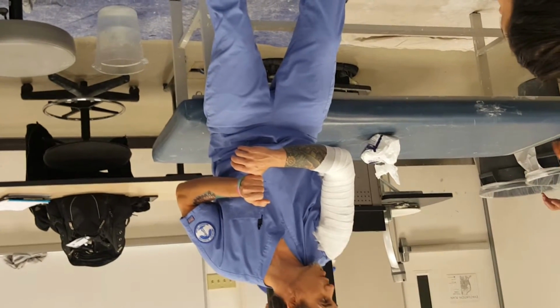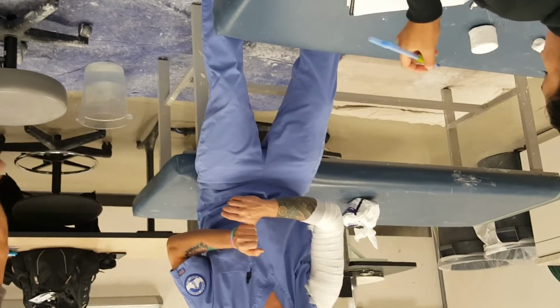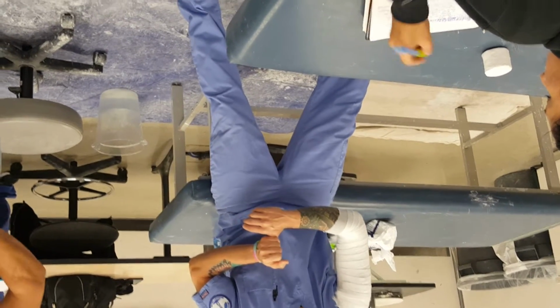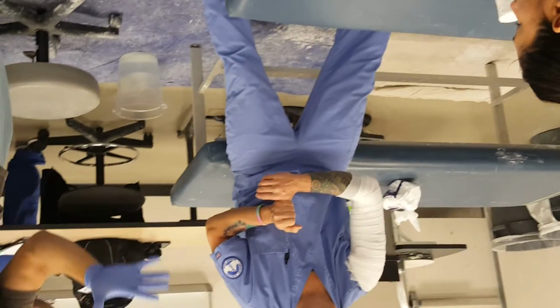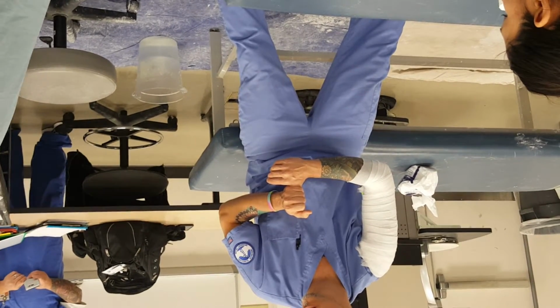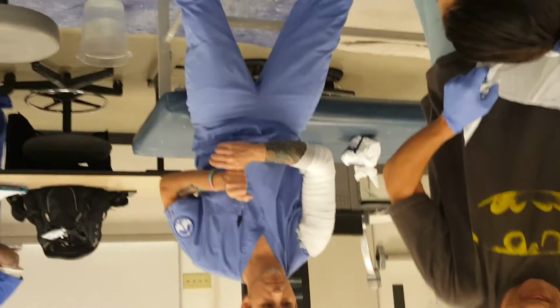This should be a very easy cast for you guys. You want 2 to 3 finger breaths from the axilla, angling it way up towards the AC joint. So you're going to watch, you get creases. It's a tricky cast to roll, but it's doable.